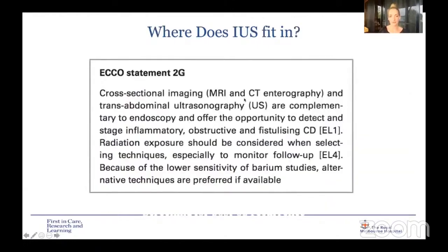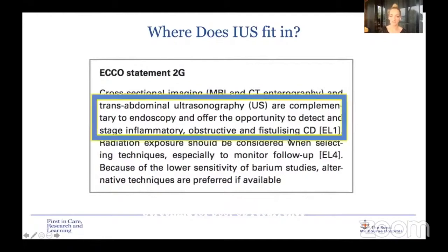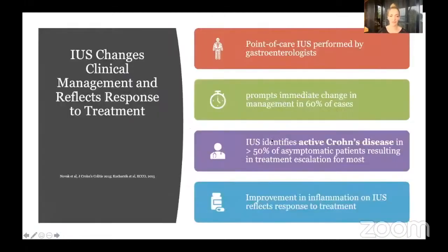So where does intestinal ultrasound fit in? Well, the ECCO statements say it can be used along with MRI and CT as a complement to endoscopy and clinical assessment to detect and stage inflammatory, obstructive, and fistulizing Crohn's disease. It's really important to note that intestinal ultrasound changes clinical management and reflects response to treatment. As I said, once you start using it, it transforms your care. We are all moving to a treat-to-target type management with our patients, and this is a really great non-invasive way to monitor our patients and make sure we're actually treating them that way.